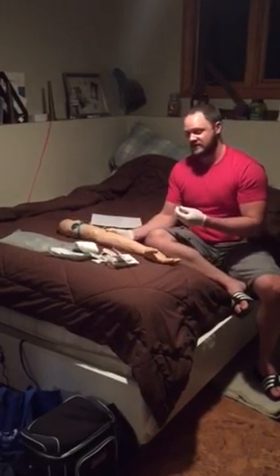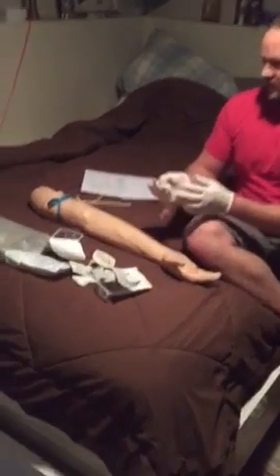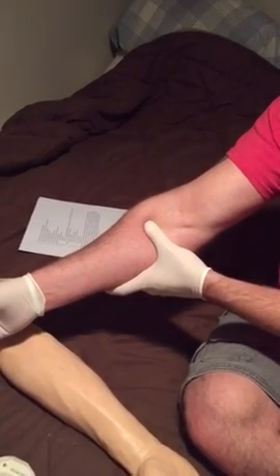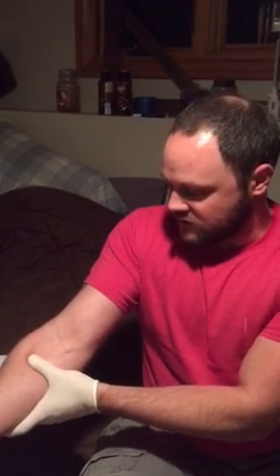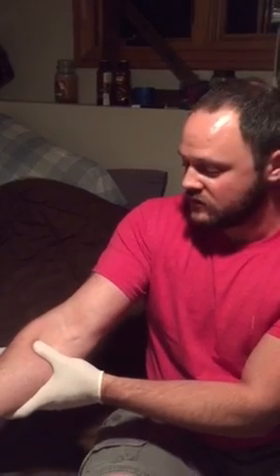When you are performing this stick, and if you want to come in here and get a closer look, what's going to end up happening is on real skin, you're going to want to pull traction as hard as you can because veins roll. Veins are pieces of flesh suspended in more flesh with fluid running through them and around them. So they roll if you're not giving good traction. So good traction is pulling the skin nice and taut so that this vein does not move and you get a good stick on the first try.